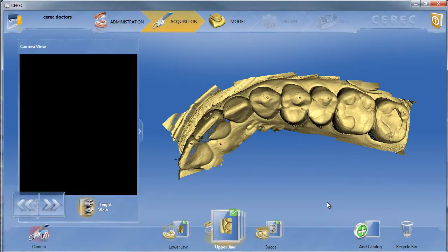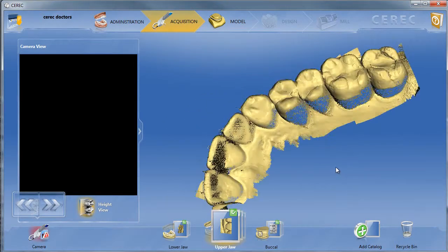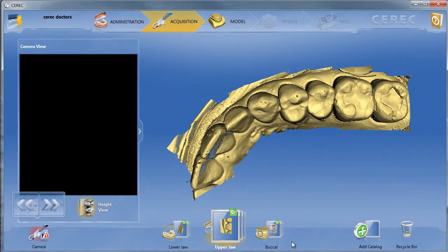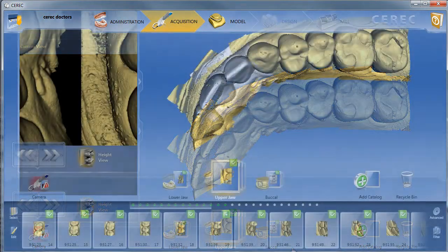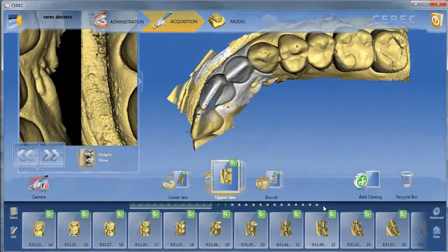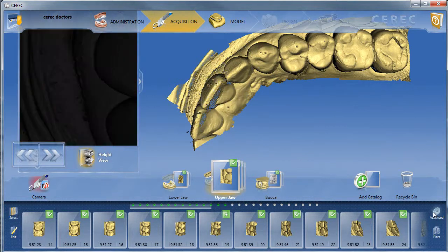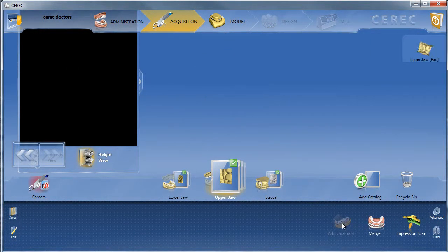I'm going to capture those optical impressions. Once I've captured those, I've gone all the way to about the central. Ideally, you should go to about the lateral or even the canine. We'll go ahead and use that Advanced feature again and place all of our images in the Add Quadrant folder.